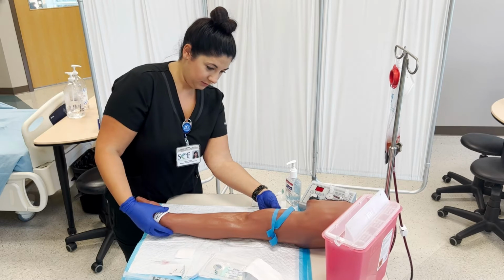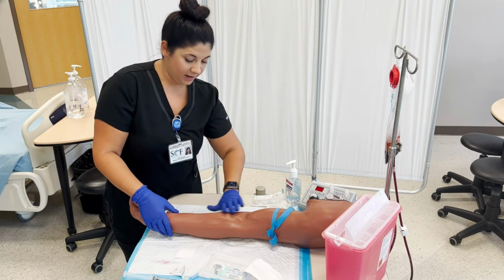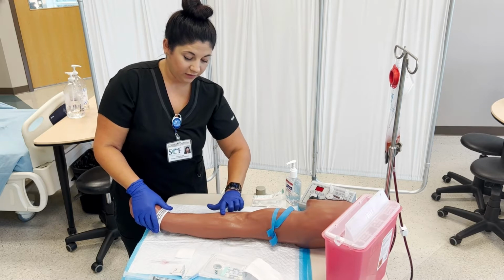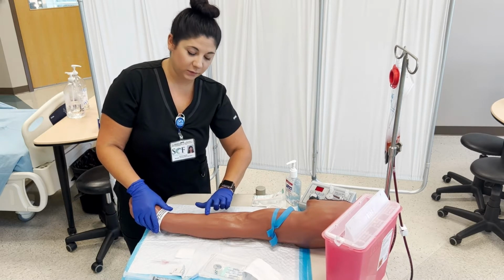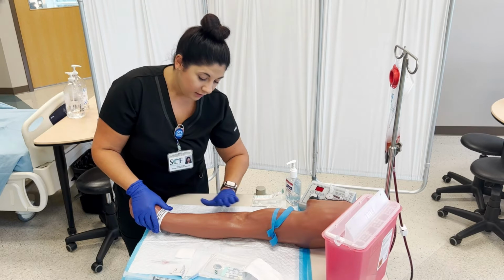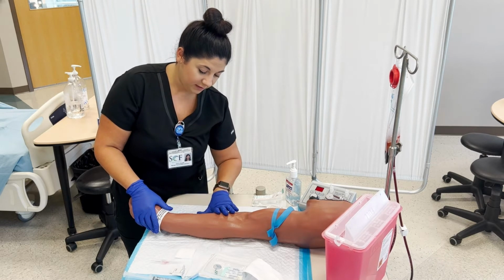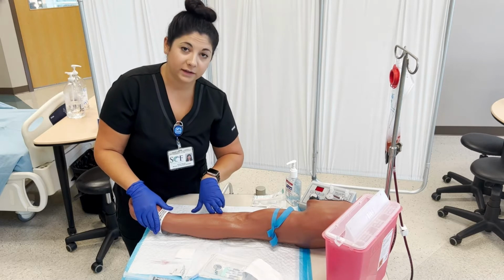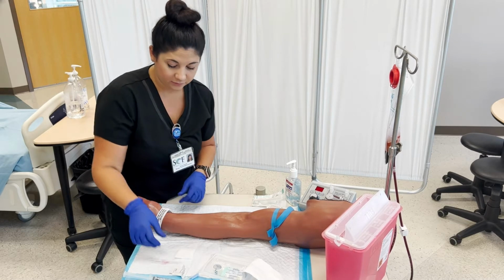Let's turn him. All right, I'm going to go ahead and use this vein. You want to make sure that you can feel it. It feels a little bouncy. It's not hard. You're looking for a straight vein that doesn't have any valves or bumps and is wide enough to accommodate the needle that you have.